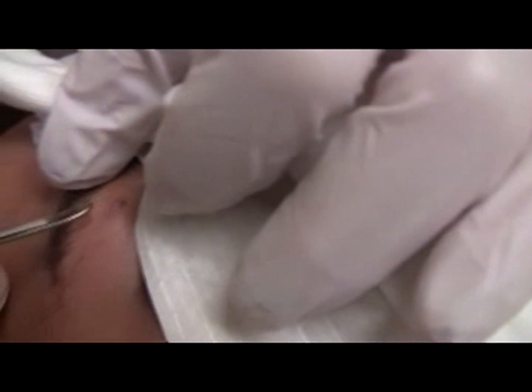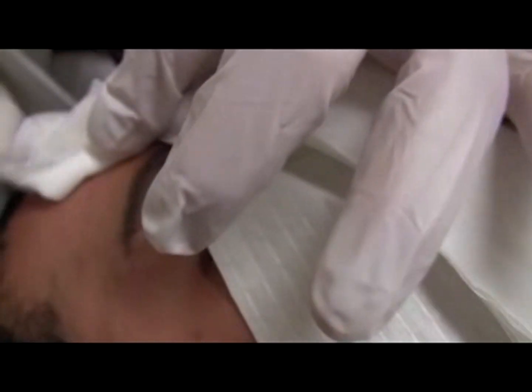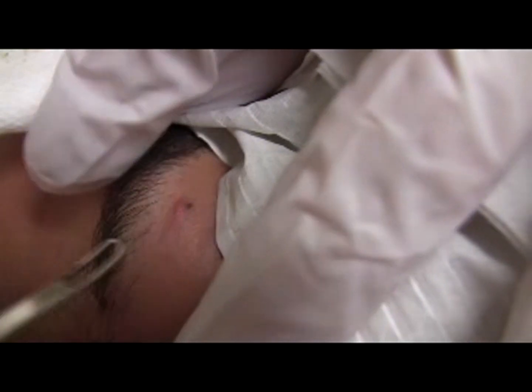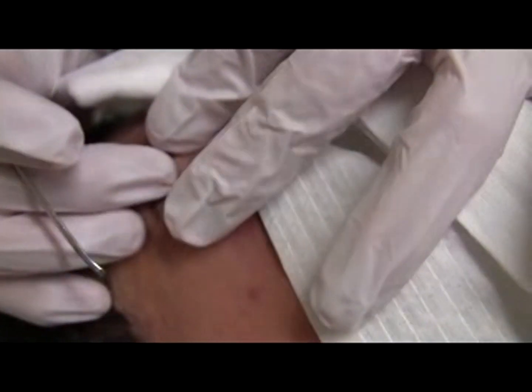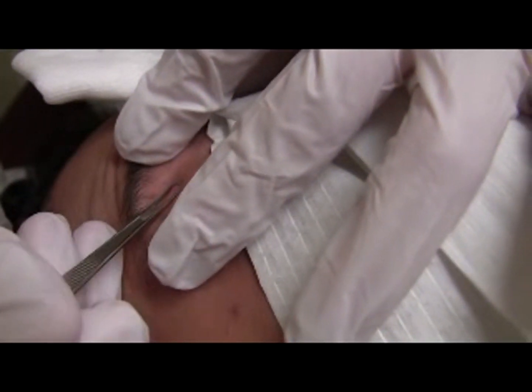For the eyelid skin, try to displace the skin over a bony prominence. If this were an acne papule I needed to extract, I obviously can't put pressure on the eye, so I displace the skin over a bony prominence and then use the comedone extractor there, pulling towards that area.